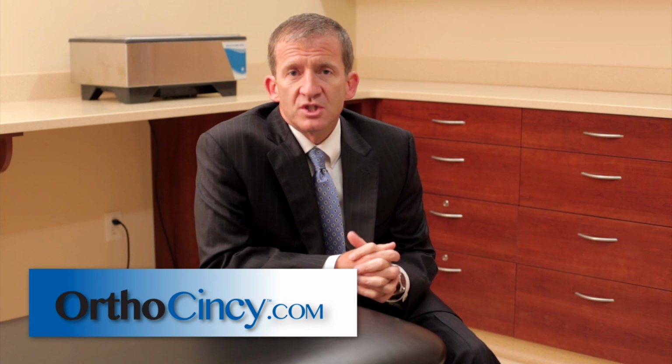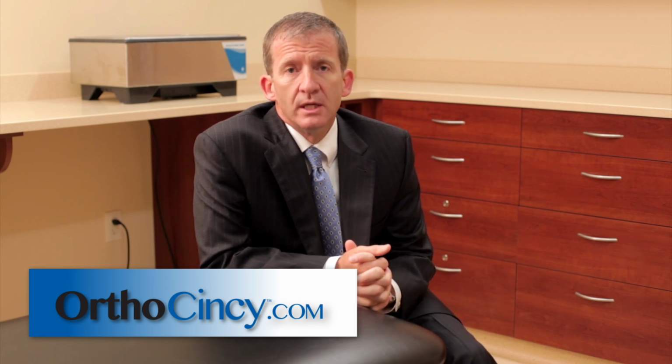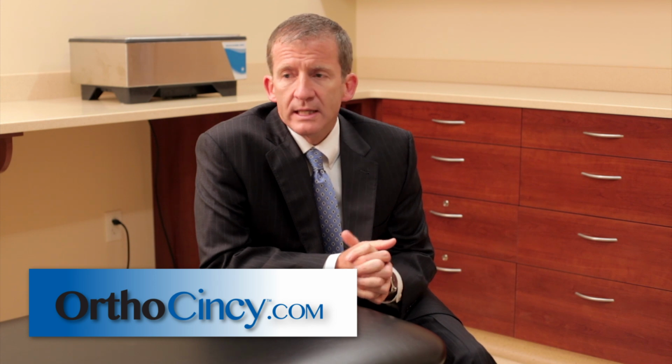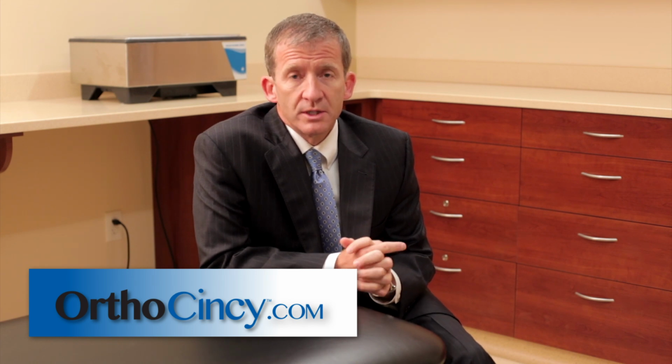Arthroscopy in the ankle is a specialized procedure that many ankle surgeons perform. I've been doing that here at Commonwealth Orthopedics for the past 18 years. Typically treated conditions include damage to the cartilage or scar tissue left over from previous ankle sprains. Cartilage can be damaged when an ankle is rolled either one time or repetitively. With arthroscopic techniques, we're able to isolate the area of damage to the cartilage.